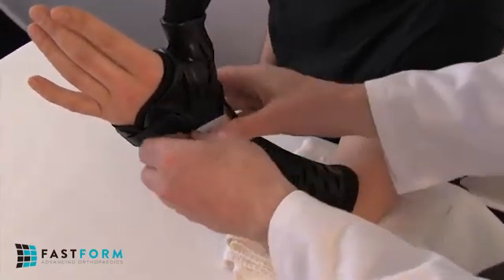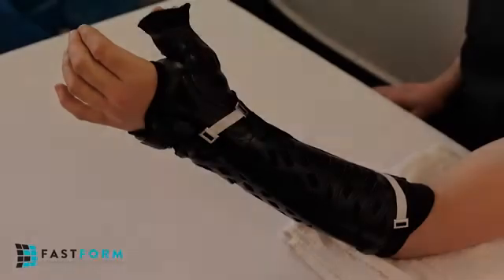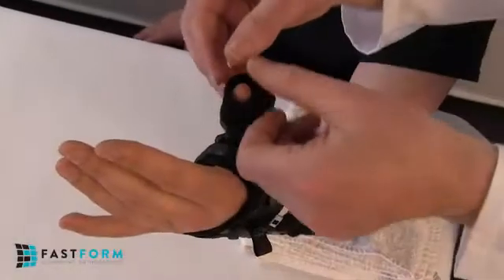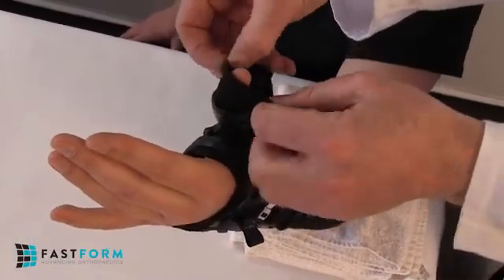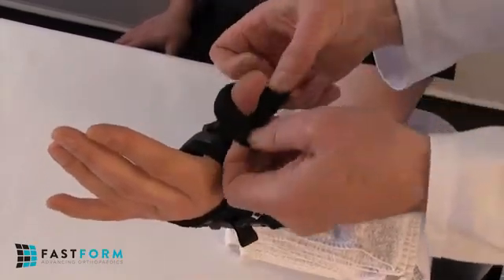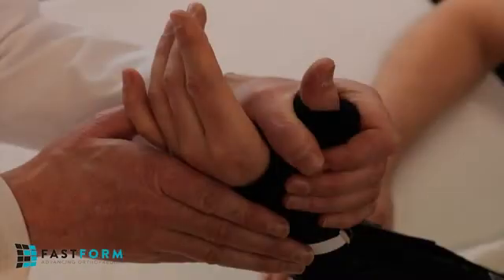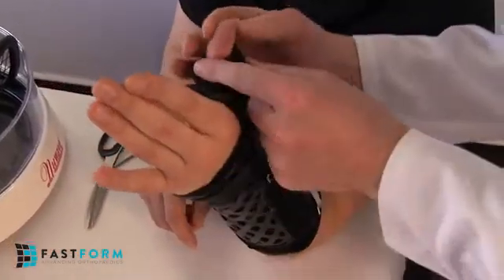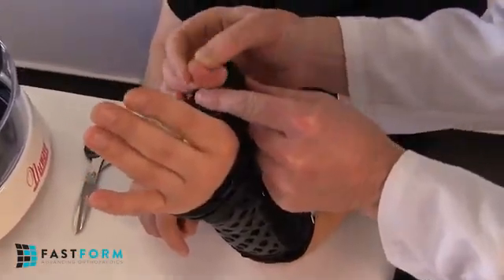Then, starting distally, attach a clip from the medial wing fabric to the Velcro on the radial hinge, and repeat with a second clip proximally. To mold the thumb spica into position, first roll the fabric liner protruding from the spica back over itself to form a padded edge. Then, if necessary, push the distal end of the spica and liner towards the base of the thumb to ensure that the Polytrex polymer is below the first IP joint for greater patient dexterity.